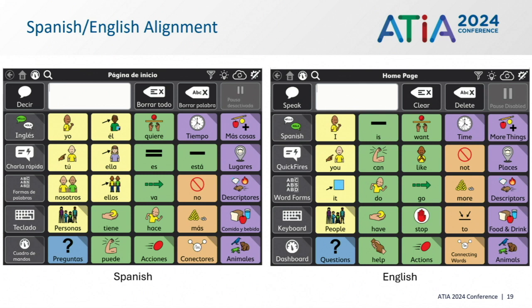But as I said earlier, 100% alignment wasn't possible unless we translate, because the language isn't reflected in that way. So when I toggle back and forth, things will shift just a little bit, but if you speak Spanish, it's just fine for you, and that's why we have this page set.